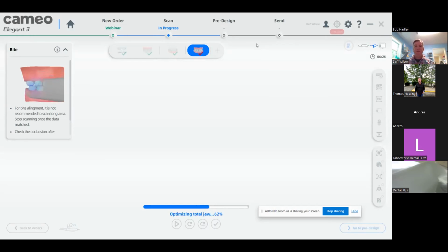You can autoclave this 100 times. You just saved $2,500, and the system comes with 5 tips. So now you're talking about $12,500 worth of savings just off the tips that this equipment comes with. And that's getting close to the price of the equipment itself. So it's almost a savings just in impression material and these tips. That's a main thing. I always try to make sure that the doctor understands the value of what they're getting with this equipment, because it is the best equipment that they can get for the value.